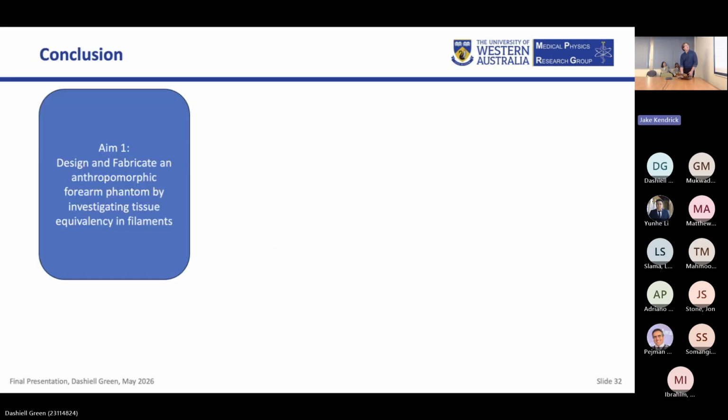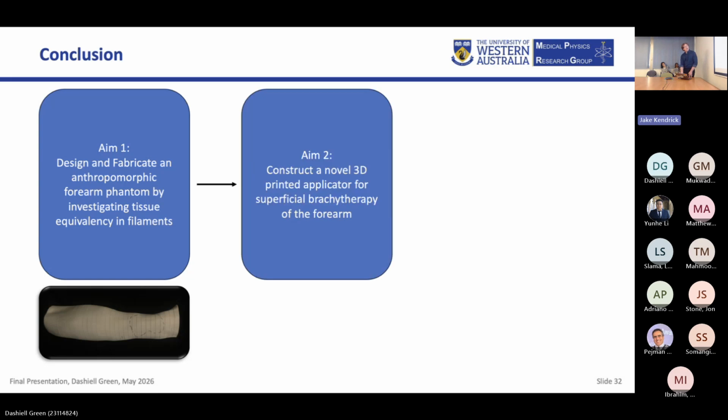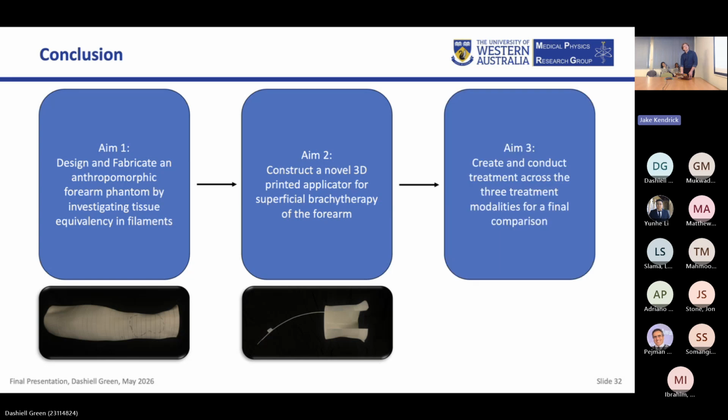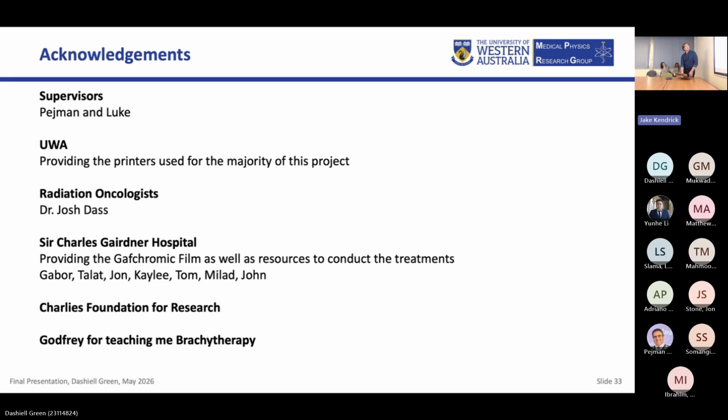So just as a conclusion, that first aim was to design and fabricate the phantom, which we were able to do to a high standard. Construct this 3D printed applicator, which was kept within all hospital protocol limits, and then conduct treatment across these three modalities, which we found brachy seemed to be the superior one, depending on lesion size.